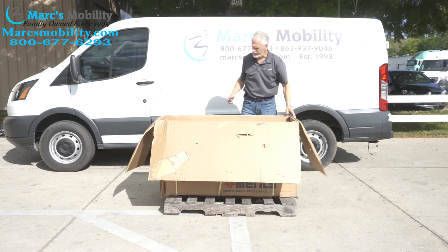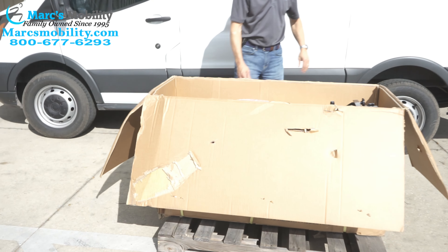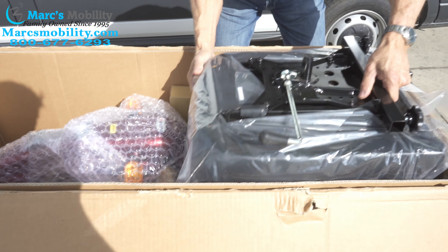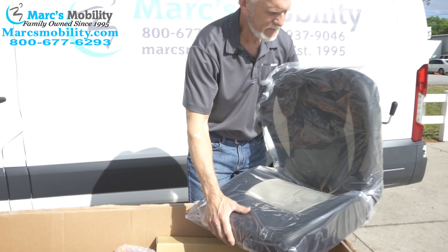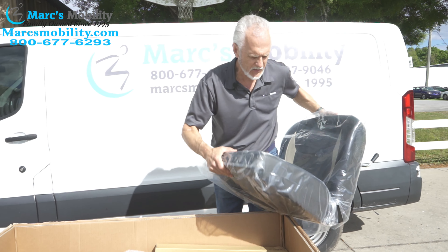When you open your box, you'll notice inside that your seat will be upside down on the scooter. So you'll pull the seat out. The seat is pretty heavy — probably 30 to 40 pounds — so you may want to have someone help you. Pull the seat out and put it over here on the side.